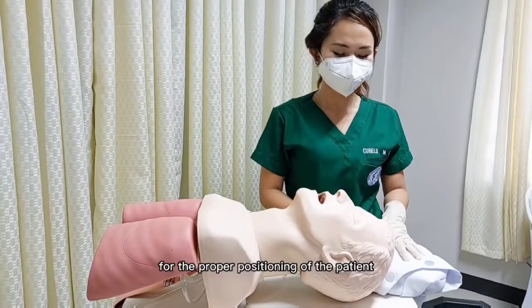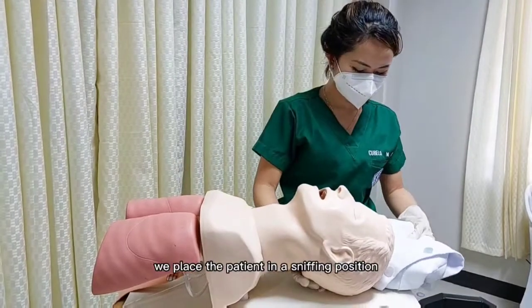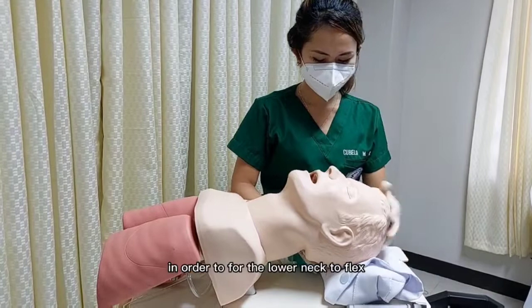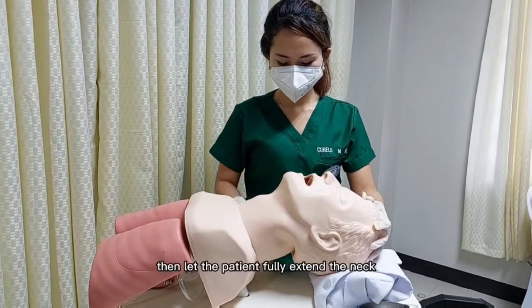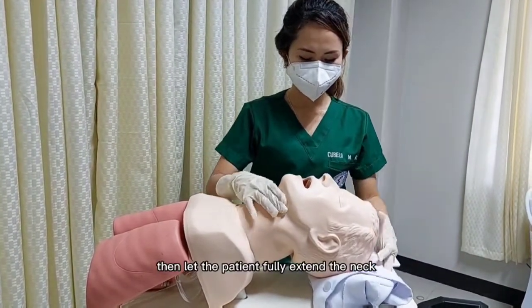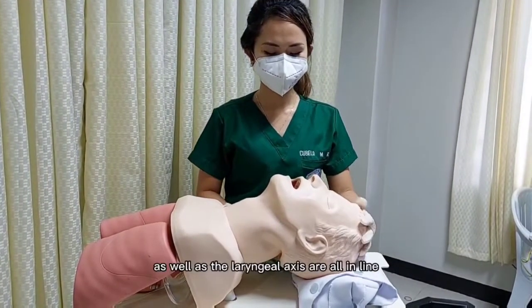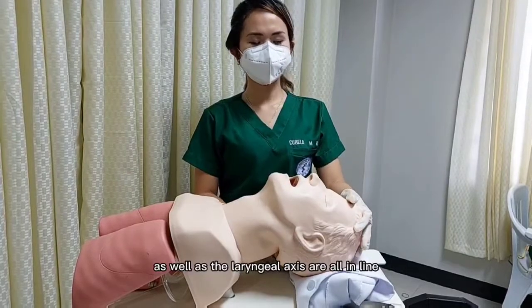For the proper positioning of the patient, we place the patient in a sniffing position. This is done by placing a pillow under the head in order for the lower neck to flex. Then let the patient fully extend the neck. With this position, you obtain a good line of vision because the oral, the pharyngeal, as well as the laryngeal axis are all in line.